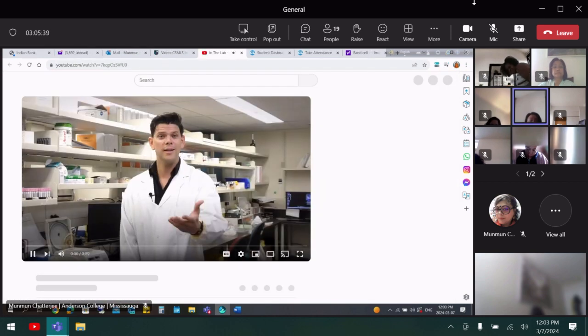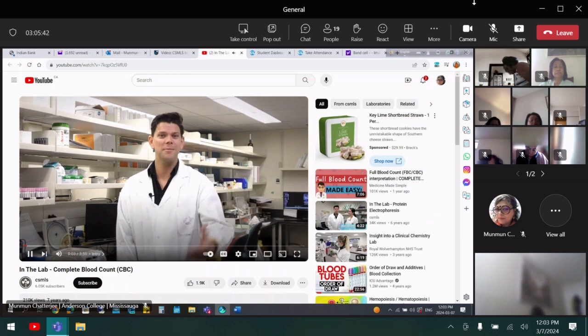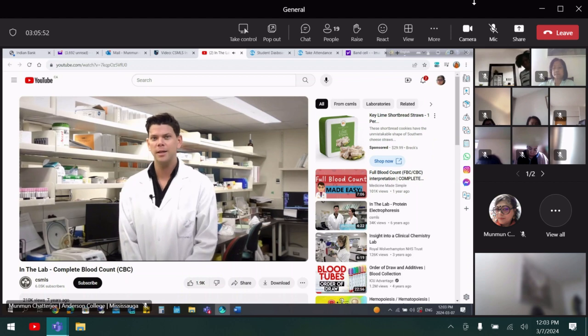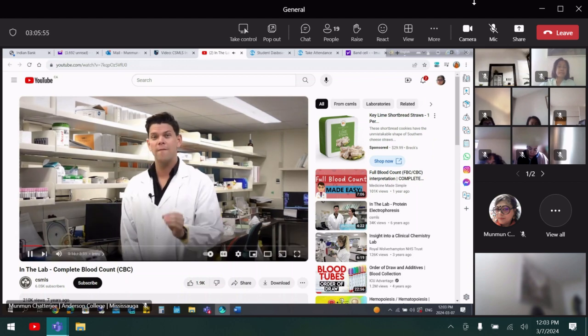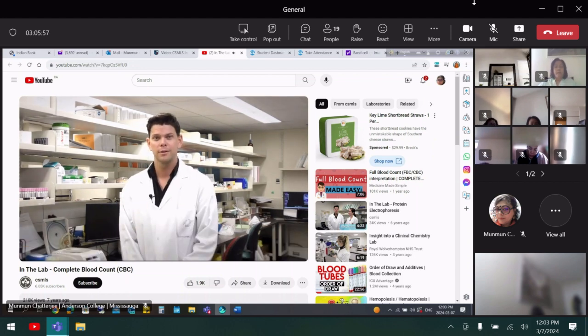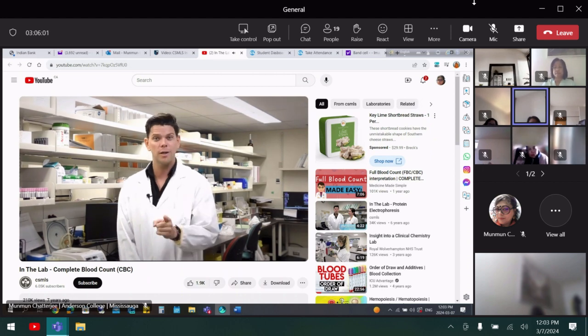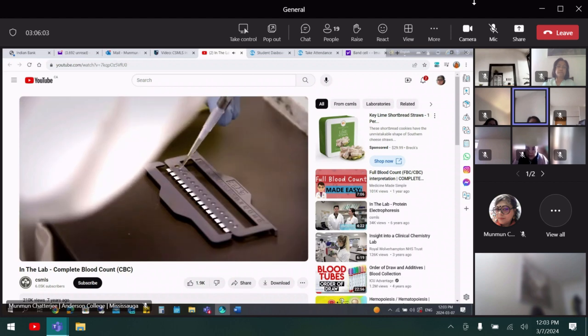Have you ever tried counting sheep to get to sleep? Maybe next time you'll count the minuscule cells that make up your blood. No? Don't worry, there's many professionals that do that test each and every day, and it is anything but sleepy. The number of cells that make up the different parts of your blood are very important to your health. I'm Andrew Chapman, and today we're counting on your blood to keep us healthy here in the lab.